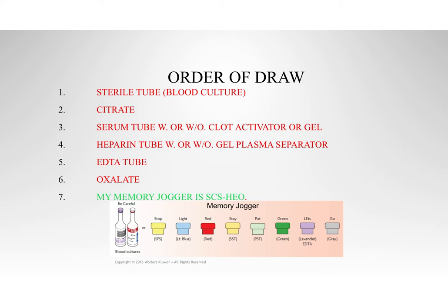Sterile, right? That's for a blood culture. So the blood cultures, it's a sterile procedure. We take extra steps to ensure that we are not getting any bacteria in those tubes or in those bottles that we use for a blood culture, right?